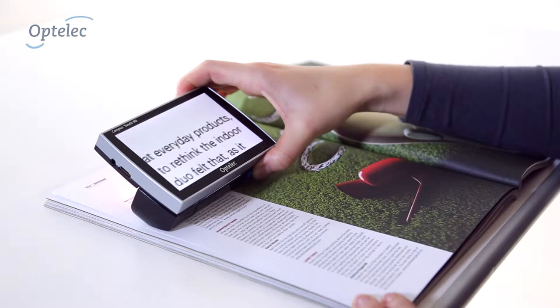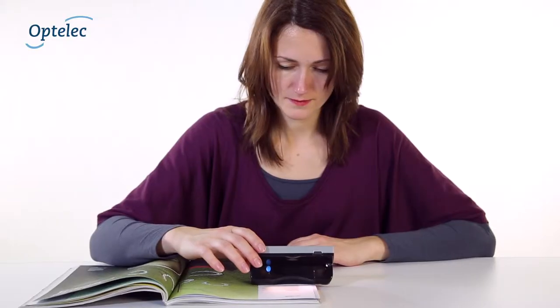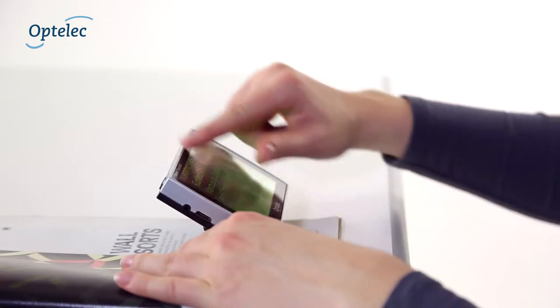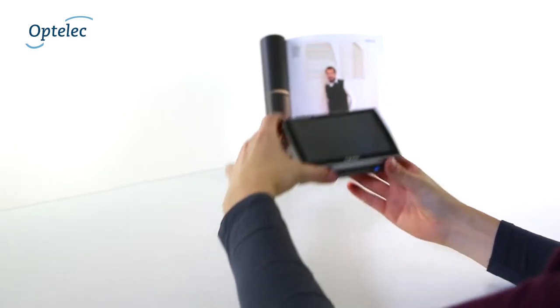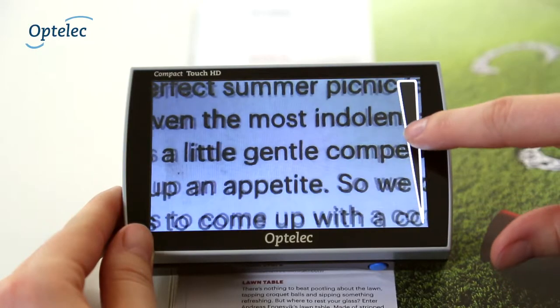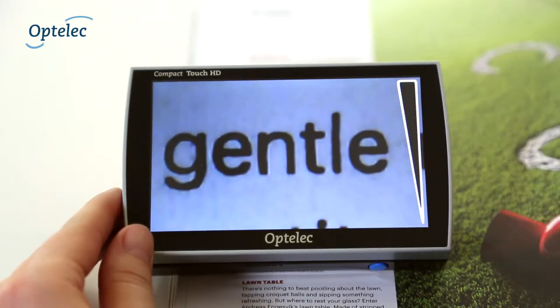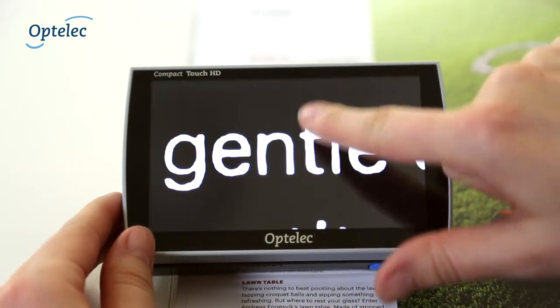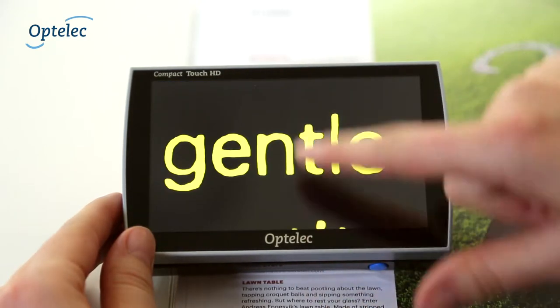The Optelec Compact Touch HD is a unique, high-definition portable video magnifier. It integrates an easy-to-use touchscreen and foldable handle for multiple reading options. You simply adjust magnification or customize your preferred settings for an optimal reading experience directly by swiping your finger over the 5-inch screen.